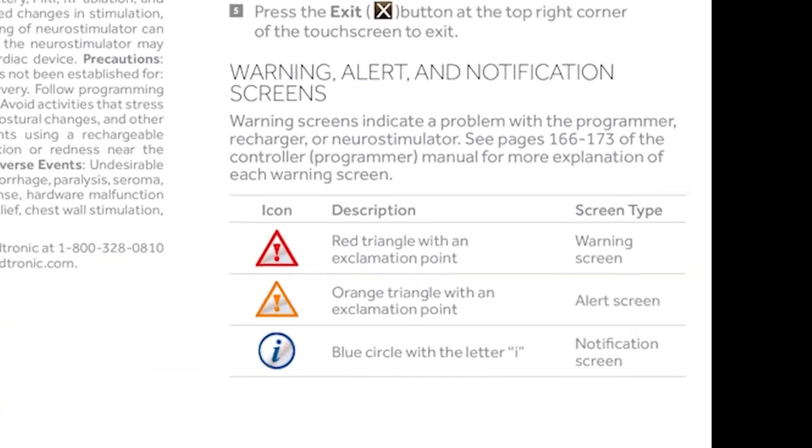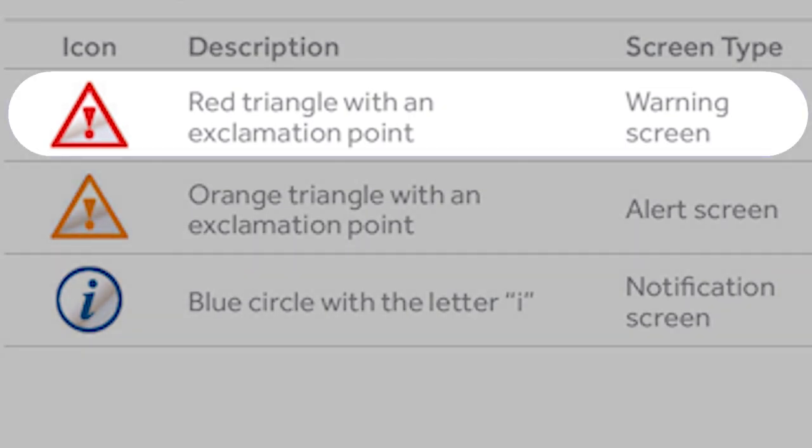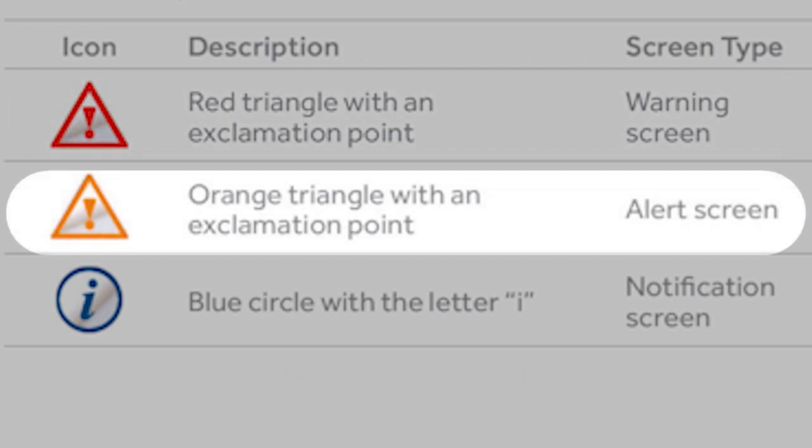Last, you might see some notifications pop up on your programmer. A red triangle with an exclamation point is a warning screen. Warning screens indicate a problem with the programmer, recharger, or neurostimulator. See pages 163 through 171 of the controller manual for more explanation of each warning screen. An orange triangle with an exclamation point is an alert screen. Alert screens indicate a pairing or other connection problem between the programmer, recharger, or neurostimulator. See pages 171 through 181 of the controller manual for more explanation of each alert screen.